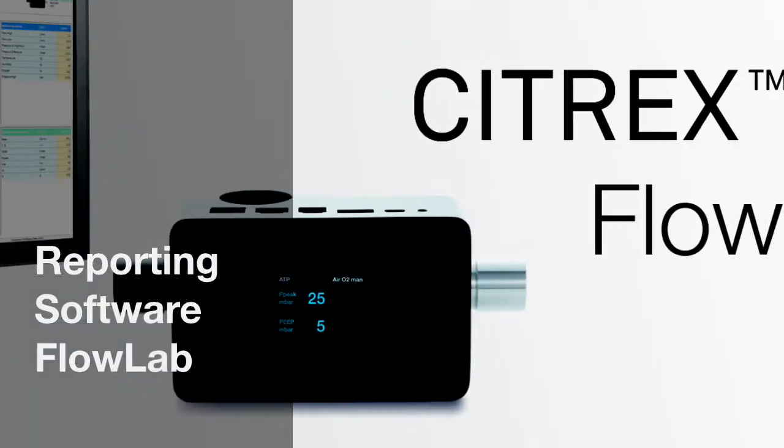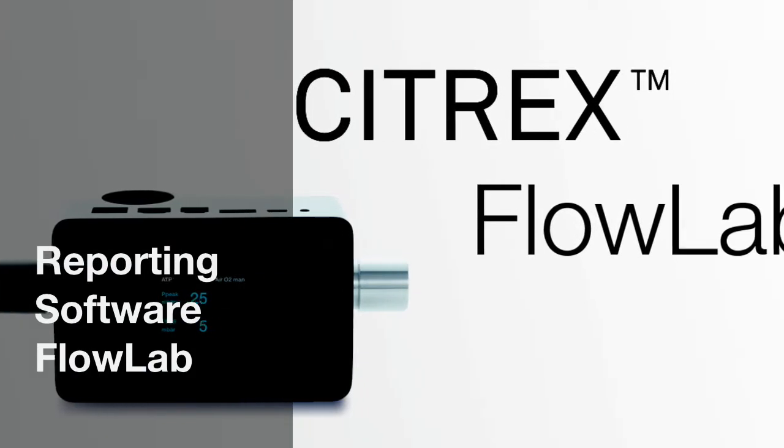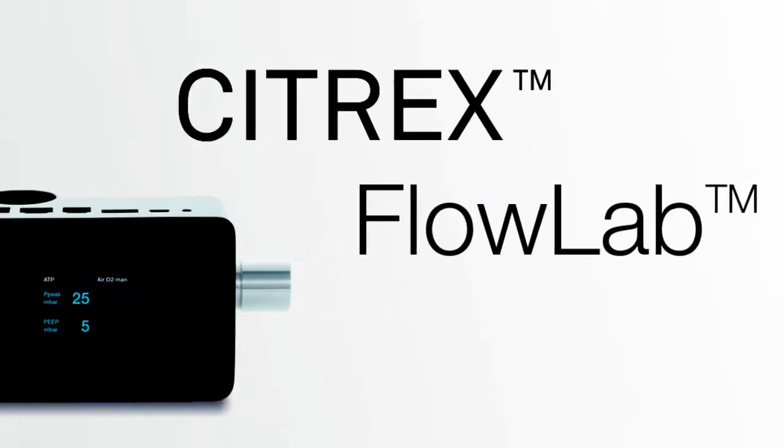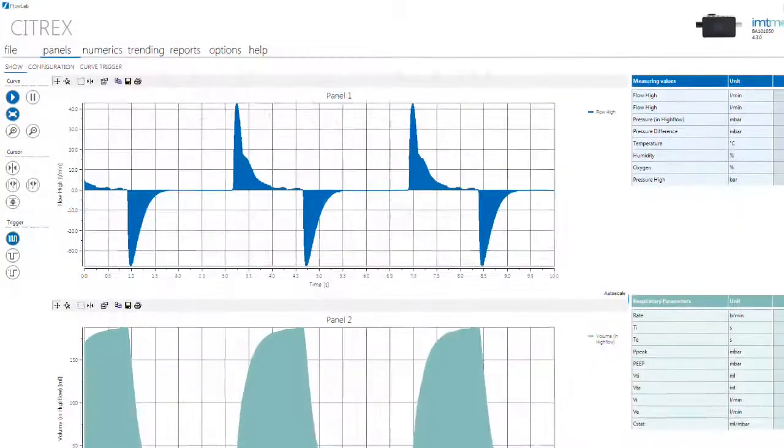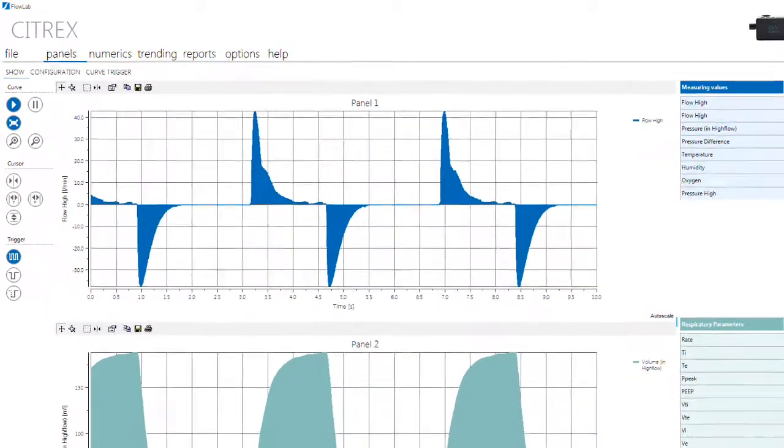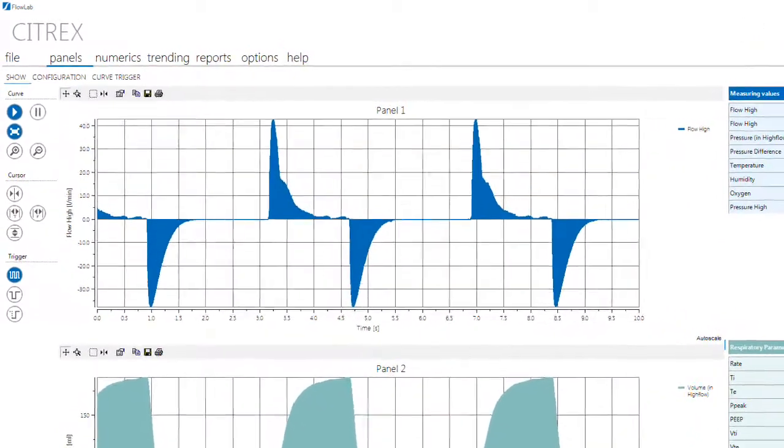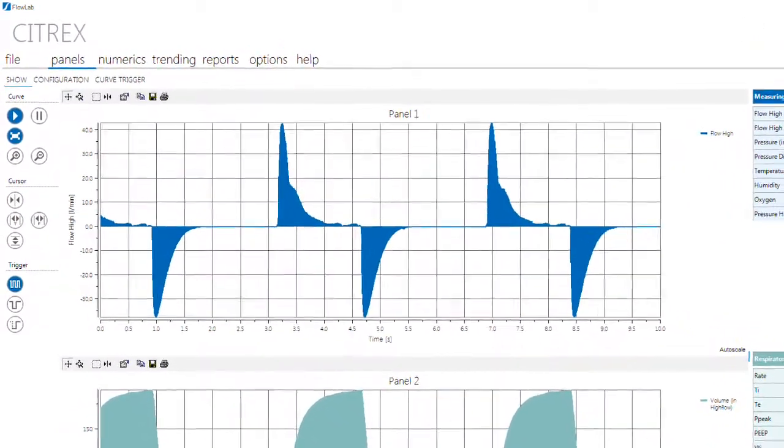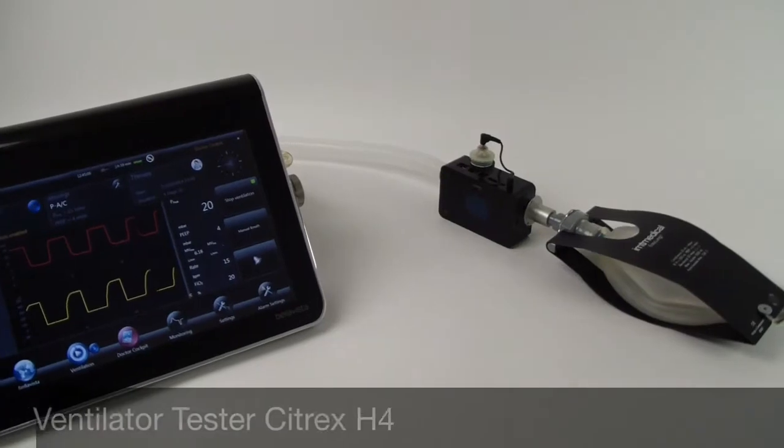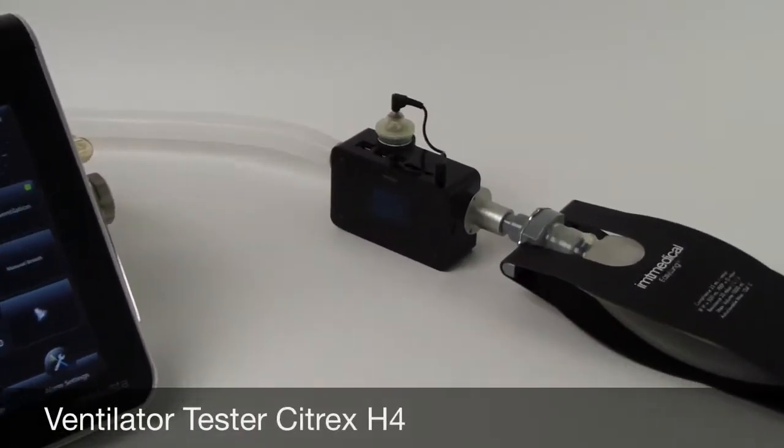The new analyzing and reporting software FlowLab is now also available for the Citrex H4 ventilator tester. The tool offers real-time curves, breath-based parameters, trending and reporting functions for biomedical engineers.